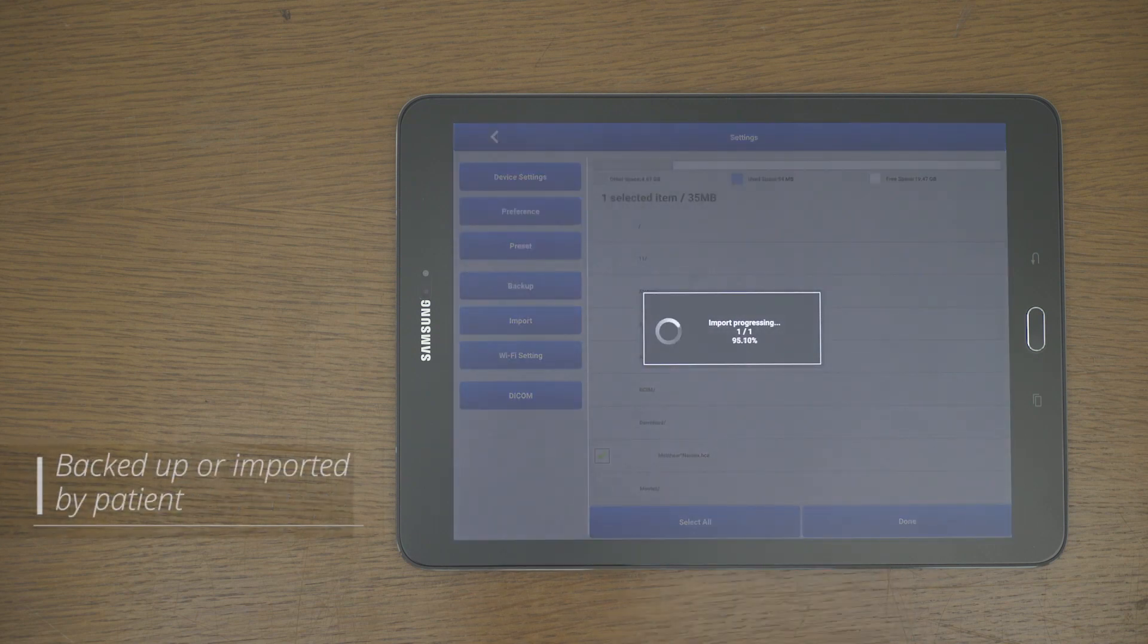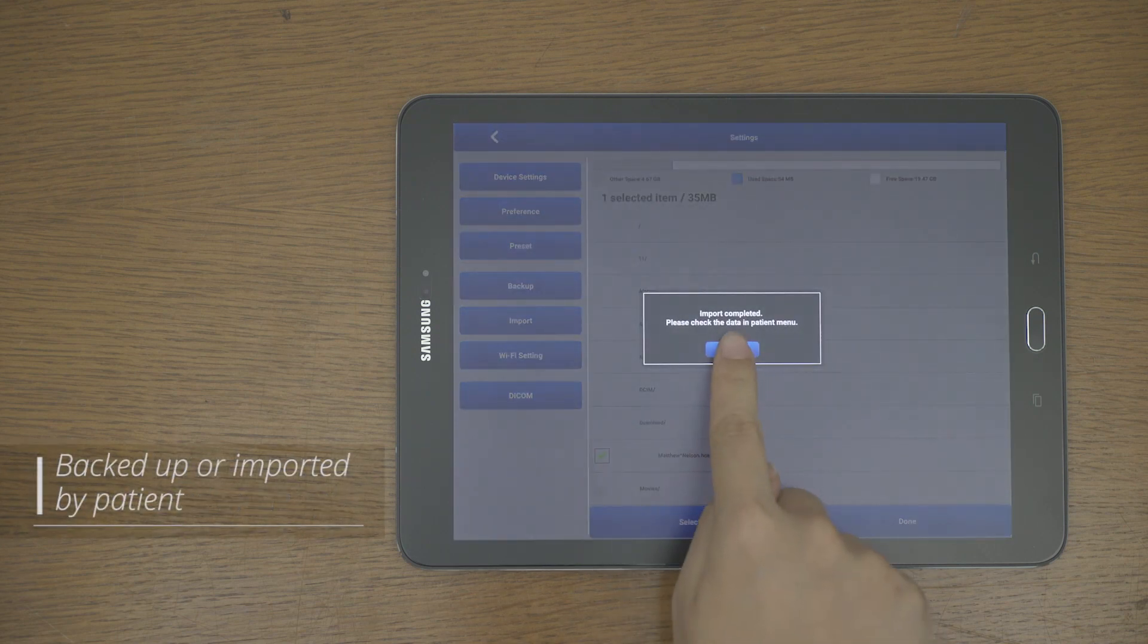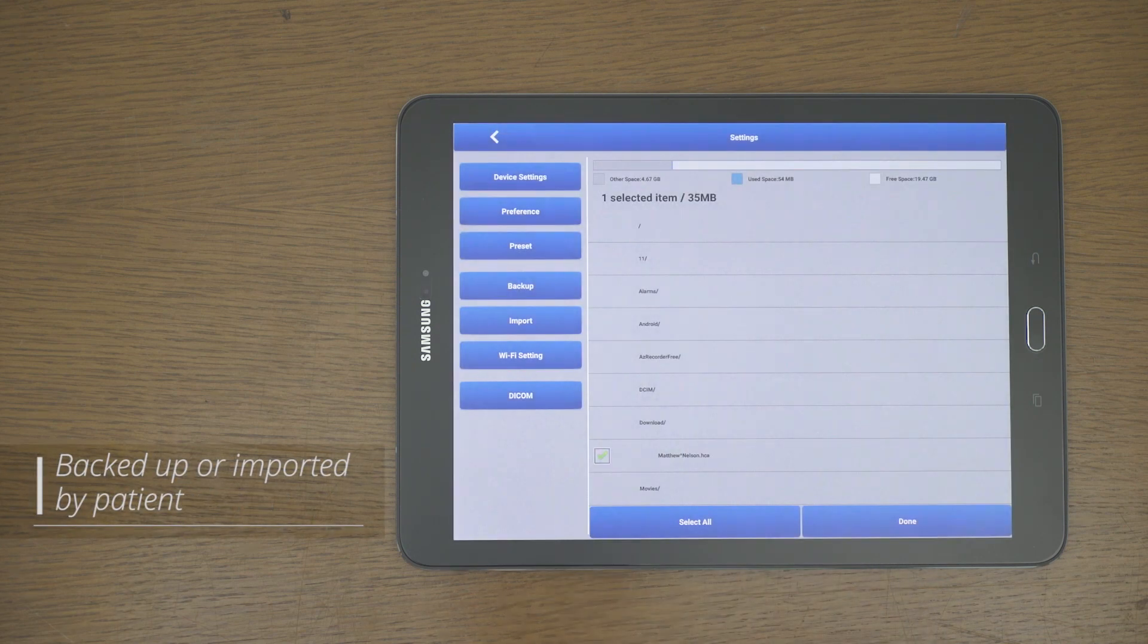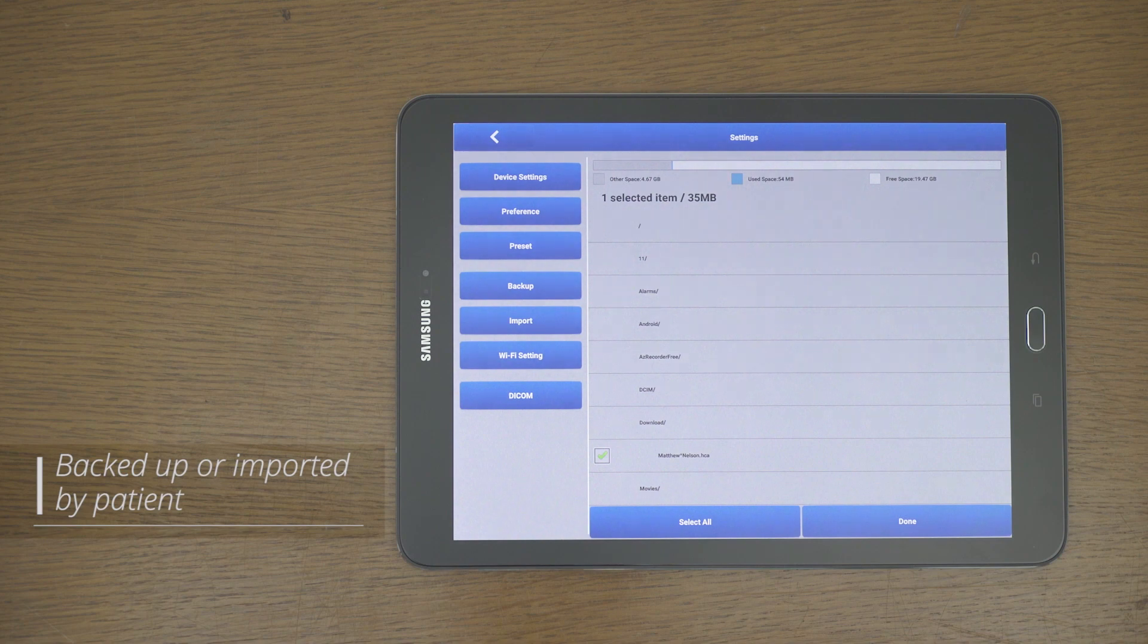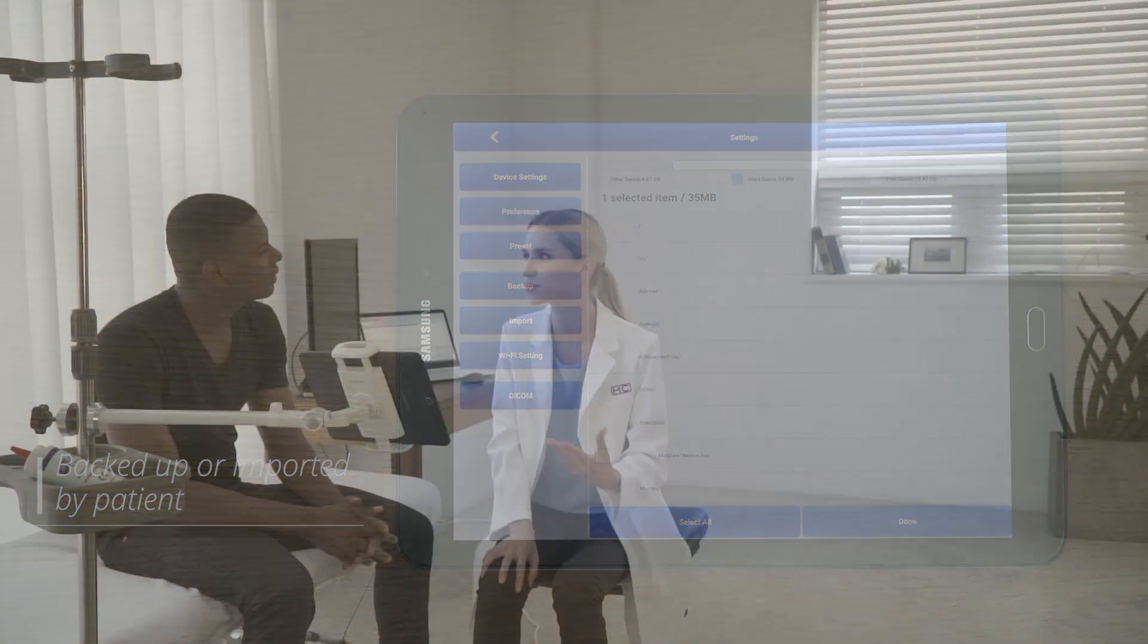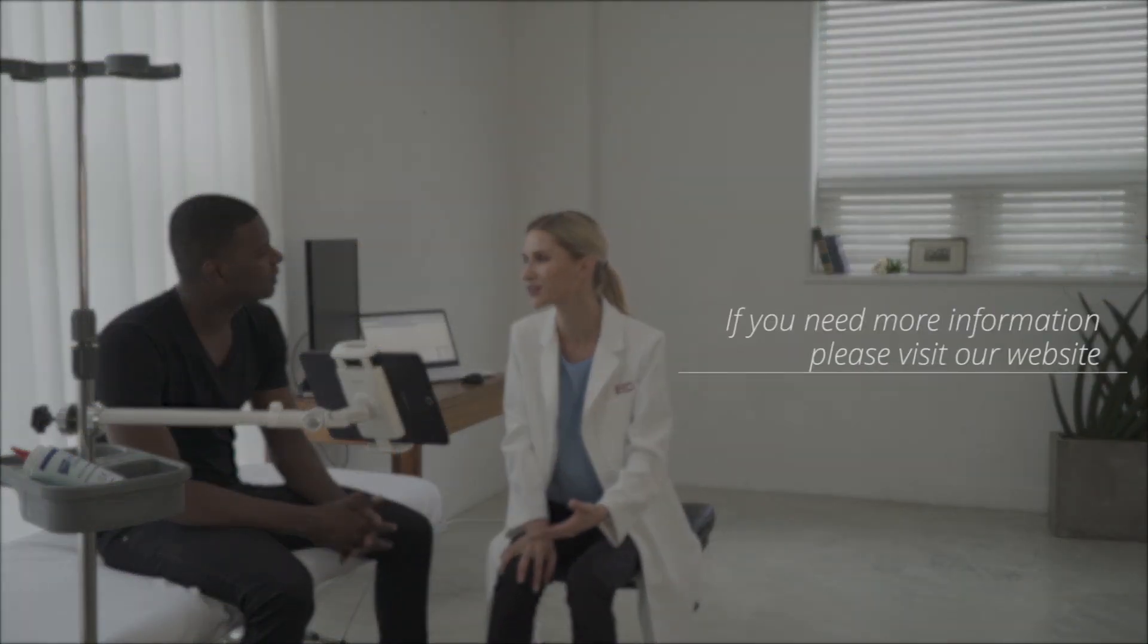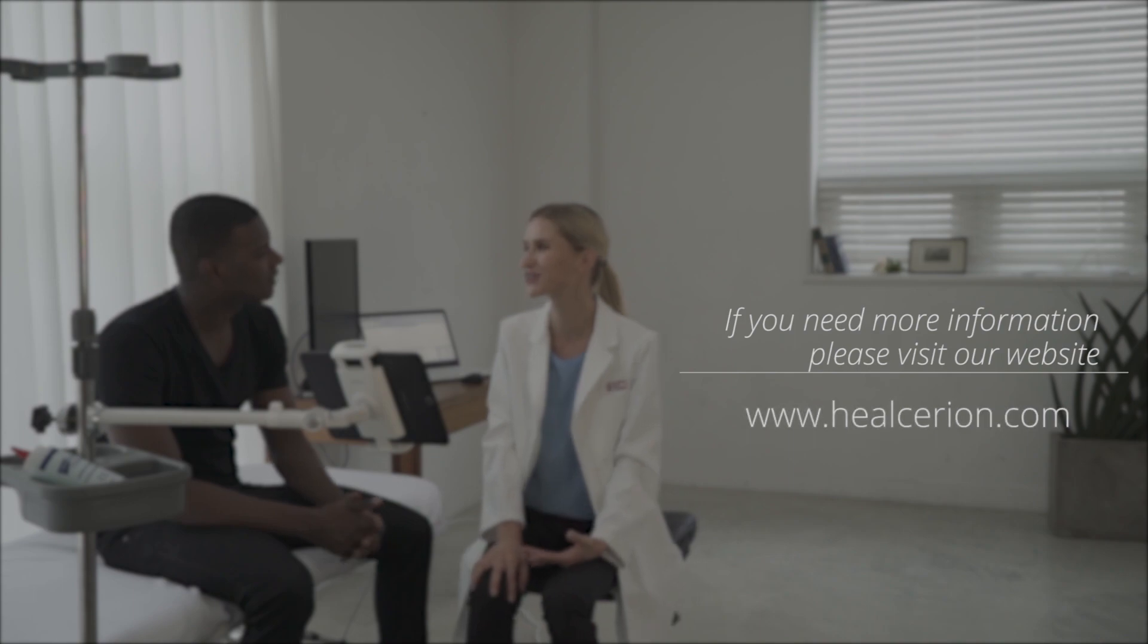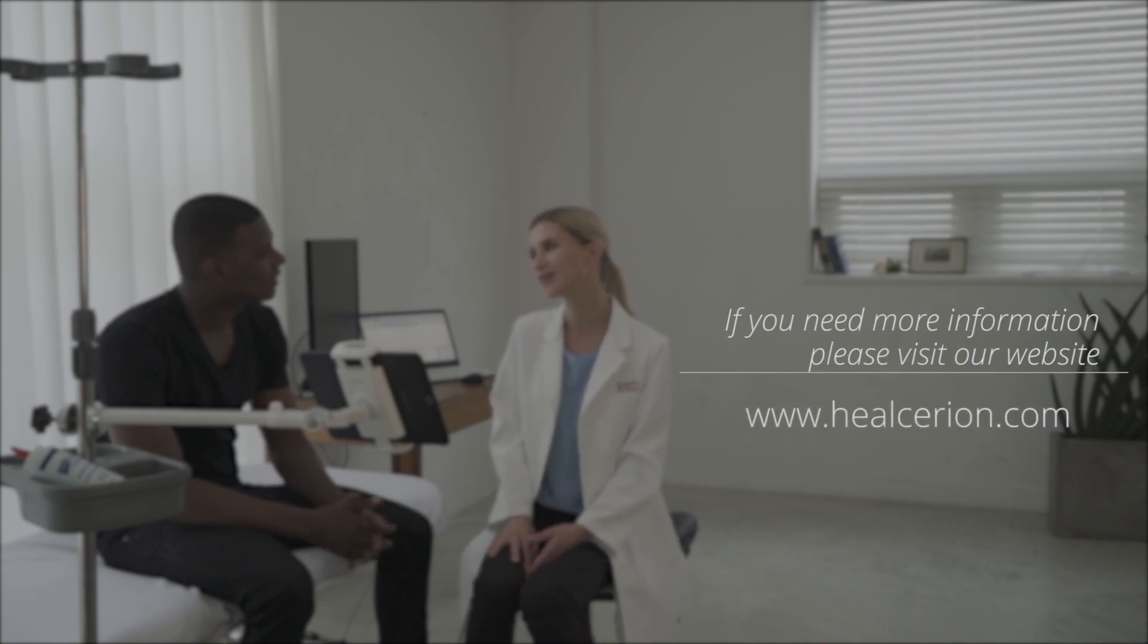It can be backed up or imported by patient that are saved with HCA extension.